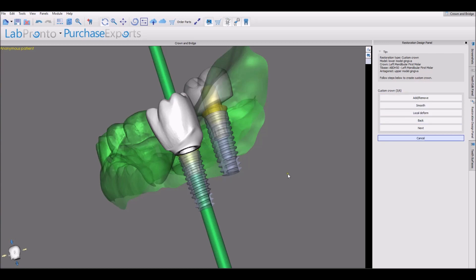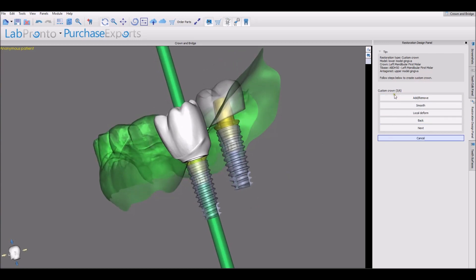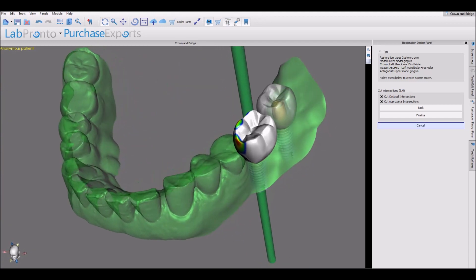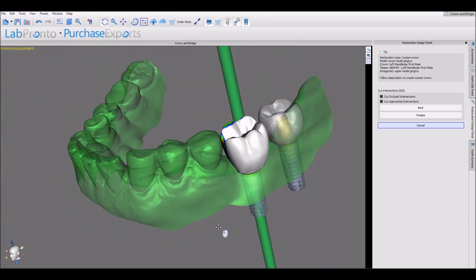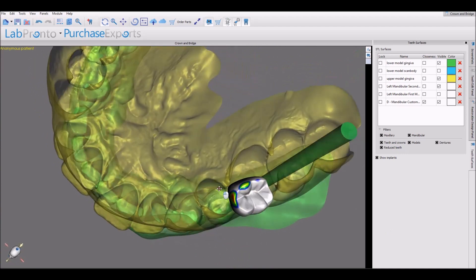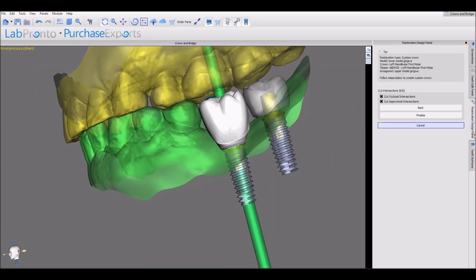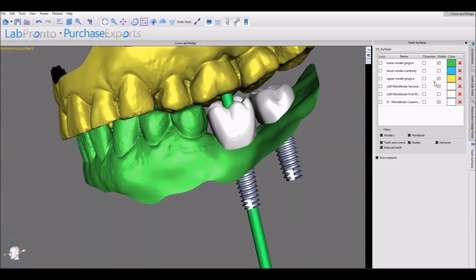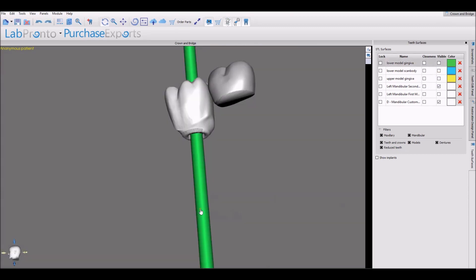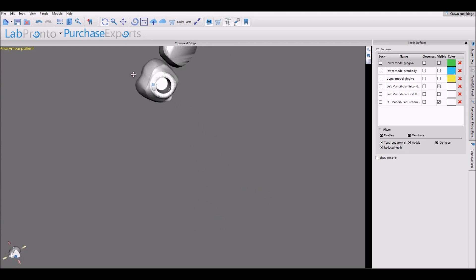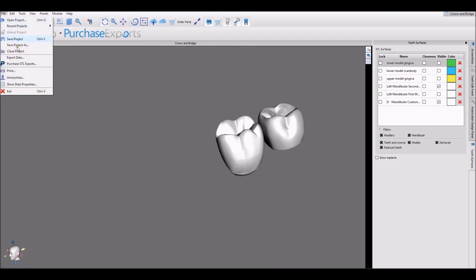We once again have our design tools to modify the crown as needed, or press Next. Finally, before finalizing, the software shows us any intersections. We can turn on the opposing arch and even make modifications through it, or choose to have the software cut the intersections automatically. Press the Finalize button and we can see the designed crown in the software, ready for export — which can be done by going to File > Export Data.